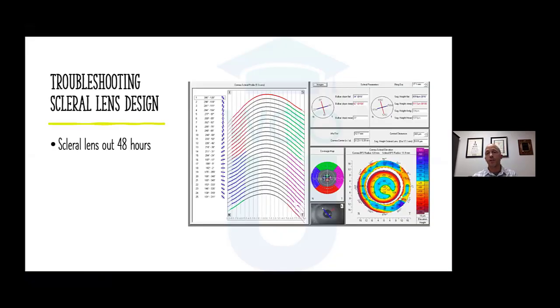So the first thing that he has to do for this patient is have the patient not wear their scleral lens, at a minimum for 48 hours. We know that scleral lenses rest on the bulbar conjunctival surface. They settle in, they of course then change the shape. So what we're looking for when we're doing an evaluation or a refit is that we need that bulbar conjunctiva to rebound to its more natural position, its more natural state. So at a minimum, 48 hours. I know that other practitioners, other experts would recommend even longer periods of time, maybe 3 or 4 or 5 days. I mean, really the longer, up to a point, the better.